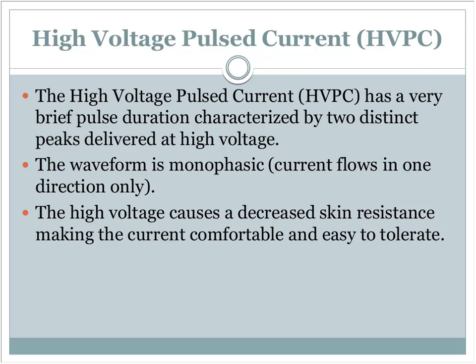High volt pulse current works very well for wound care because when wounds are healing, they require different nutrients and different supplies. Some of those things are positive, some of those things are negative. Opposites attract, okay? That happens especially in electricity, not just in relationships. So if you put the positive over a wound, you're going to attract a lot of negatively charged molecules and ions to that area that the body will need in order to heal that wound. You put the negative over the wound, you're going to attract a lot of positive. The body needs both.